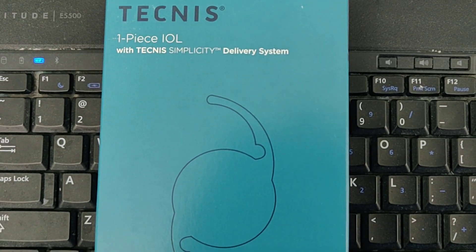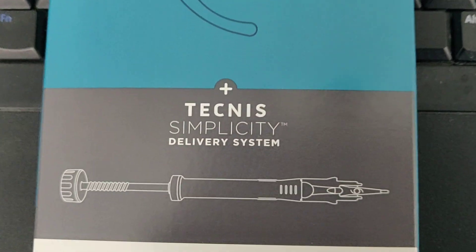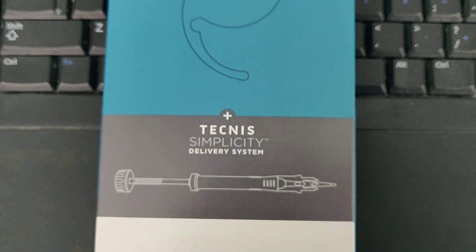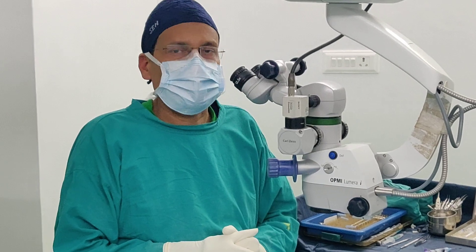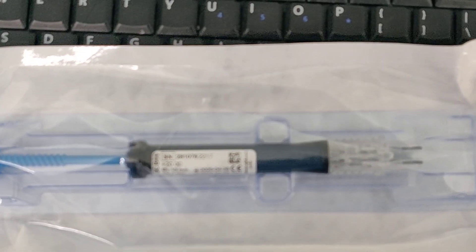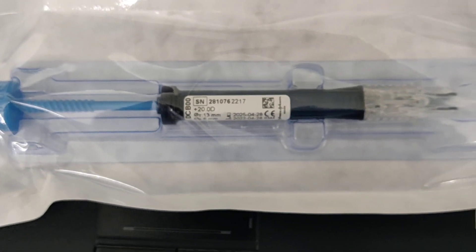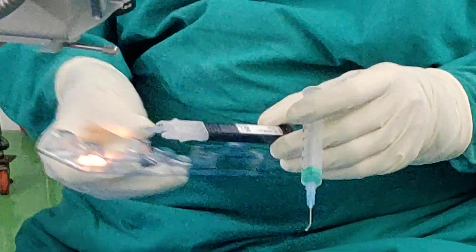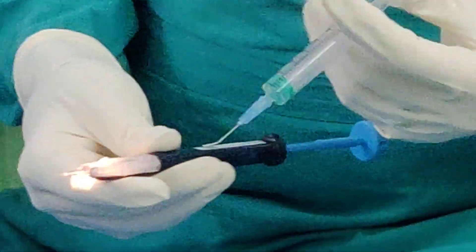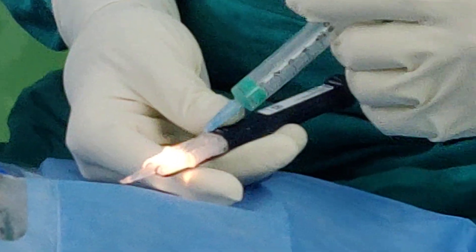The Simplicity Delivery System is a pre-loaded lens manufactured by J&J, Johnson & Johnson. The system comes in a package and the first step is to open the package. We need to carefully remove the device from the sterile support and then carefully put the viscoelastic or VSS solution in the hydration port.